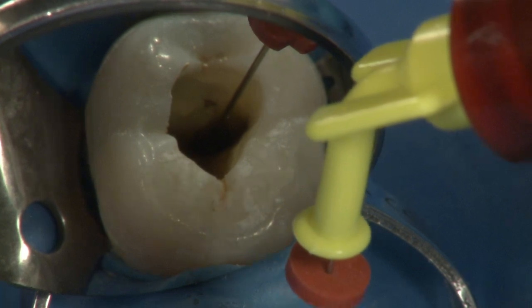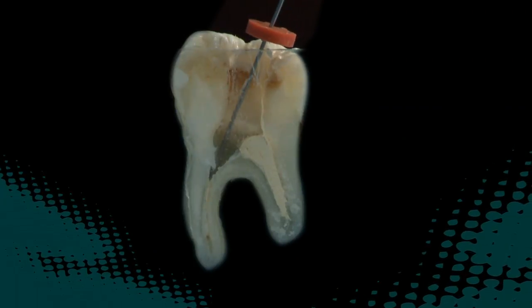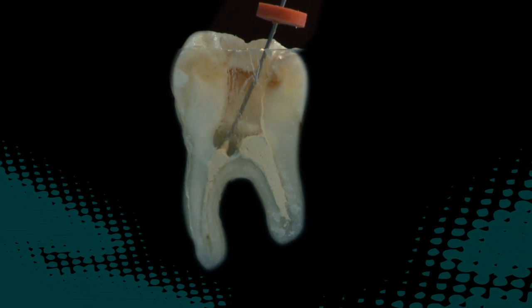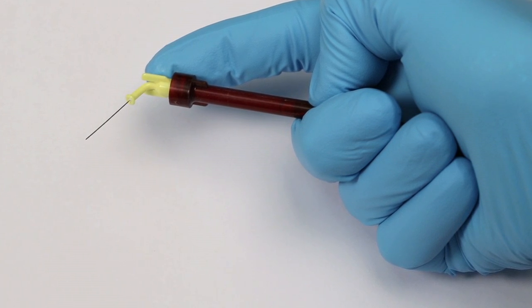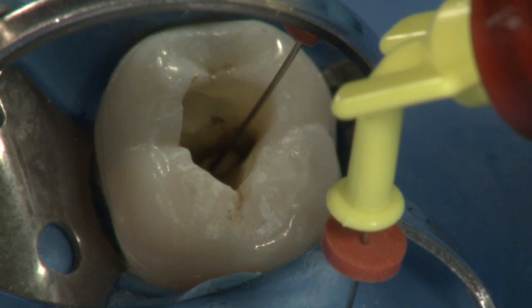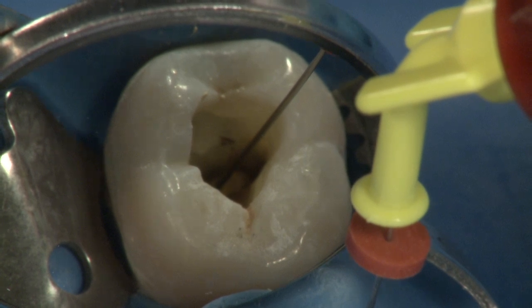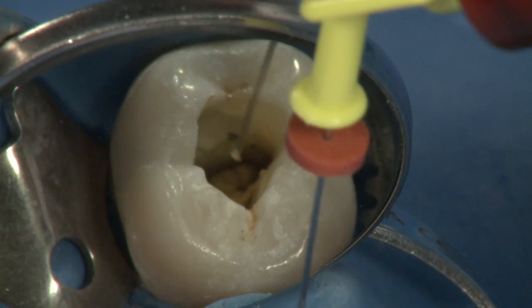If EndoRes is not flowing up the canal around the Navi tip, stop delivering and check to see if the tip is clogged or that material is not being expressed past the apex. Do not use excessive force on the skinny syringe plunger to express material, as this may push material past the apex. Stop filling the canal about 1 millimeter short of the canal orifice. There is no need to fill the pulp chamber with sealer, as cleanup will be more difficult.